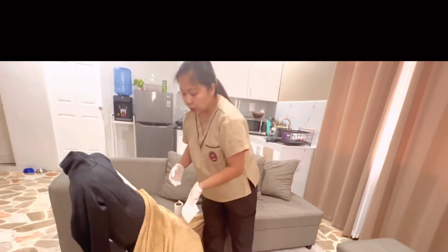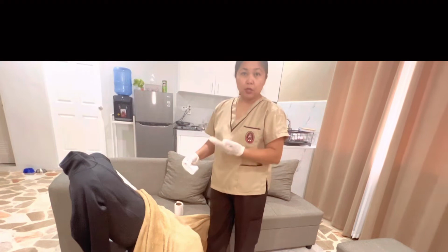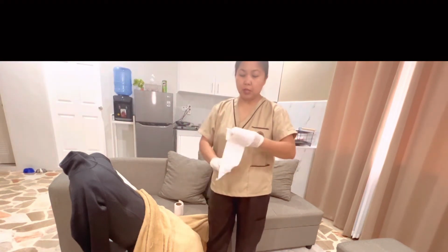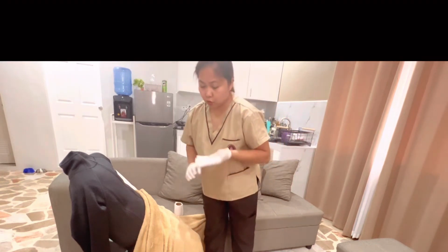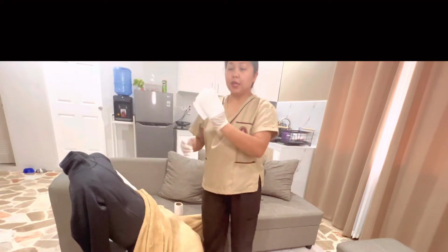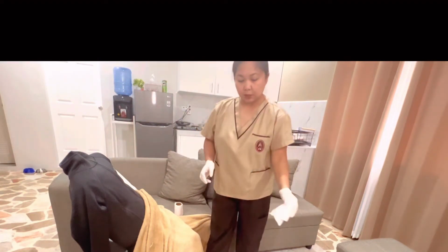So once you've done the front to back, you would like to check if it's clean or not. If not, you would like to get another roll, put it on your hand, and then do the same stroke from front to back, from pubis to anal, and then check if everything is clean. Once it's clean, you would like to throw this in the proper receptacle.